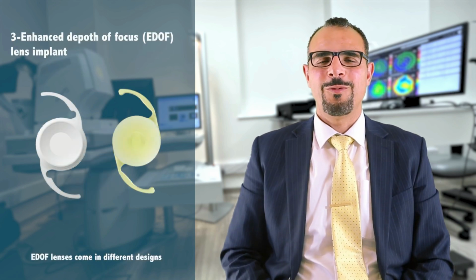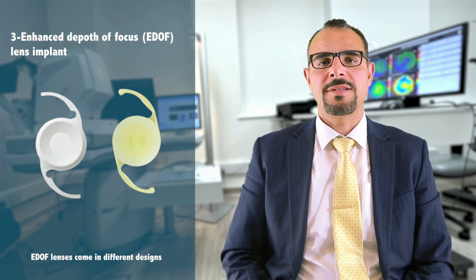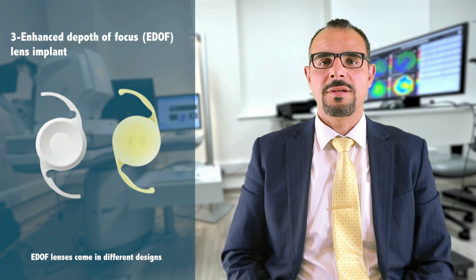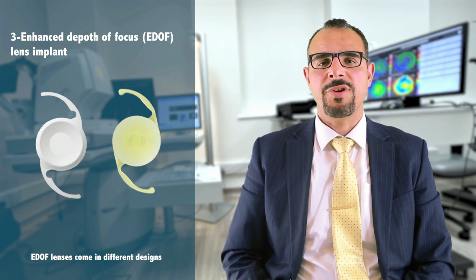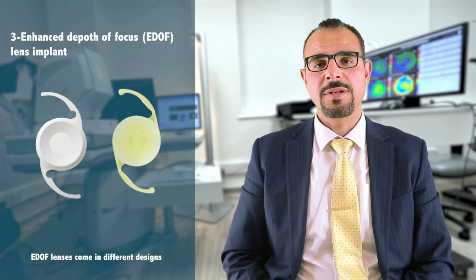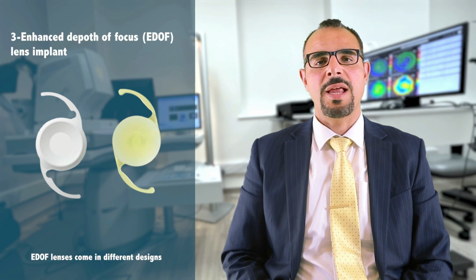Extended depth of focus lenses. This new technology of lenses elongates the focus of the image, which may help to some extent increase the range of vision or the depth of focus, so they can give some distance as well as intermediate vision.